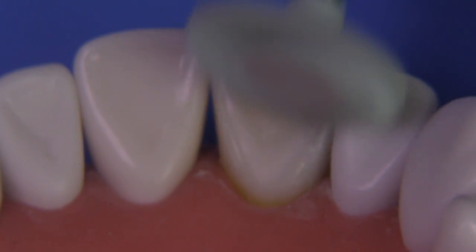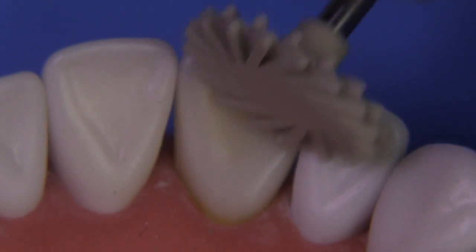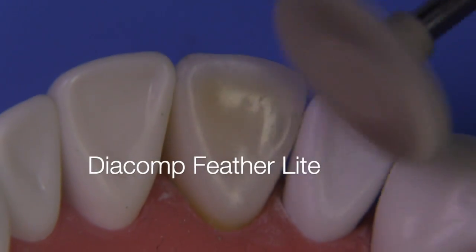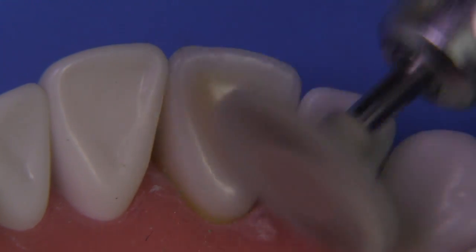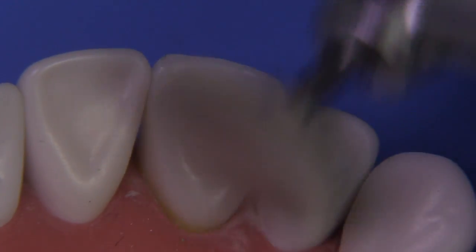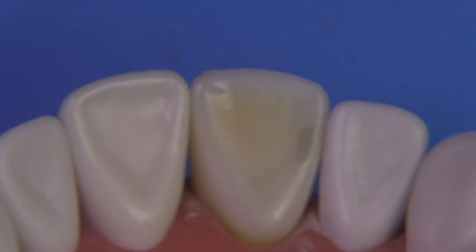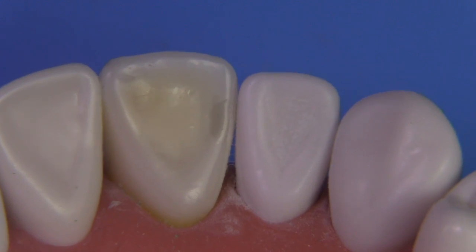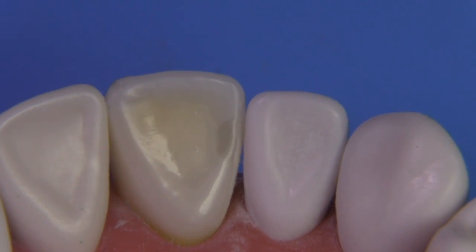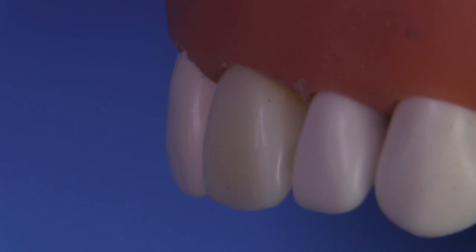Then finally we're going to use the Feather Lights — first the green and then the gray. This entire procedure takes no more than about 30 minutes and you can end up having a pretty good result when you're finished. And here we have the final result. It didn't take very long to accomplish, and I think that this would keep your examiners pretty happy. You can look at this from the facial and make sure that you don't have any flash in that area.